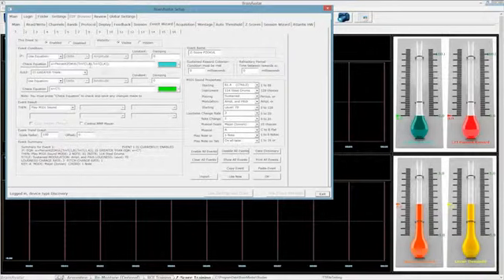The other nice thing about this, and I've said this in the Zscore webinar, but I'm going to say it again, is that if you change the BrainDX or the BrainMaster Zscores, you don't have to do any fiddling with this. It is always going to look at the 8th band and the 4th band's threshold no matter what you change to. So the nice convenient thing about functions, which I'm going to reiterate, is that you change nothing.